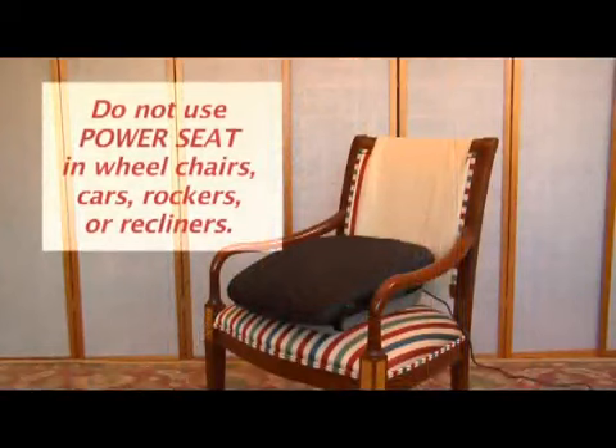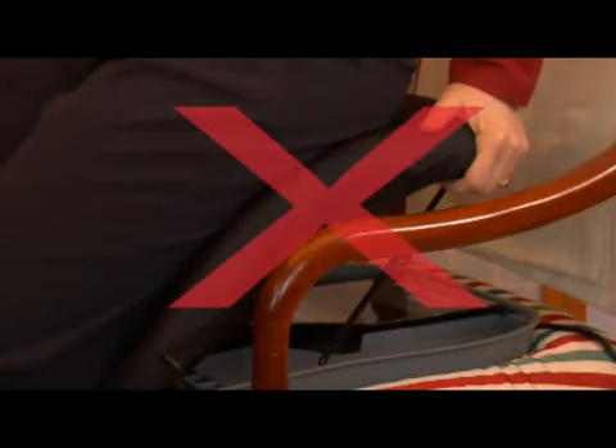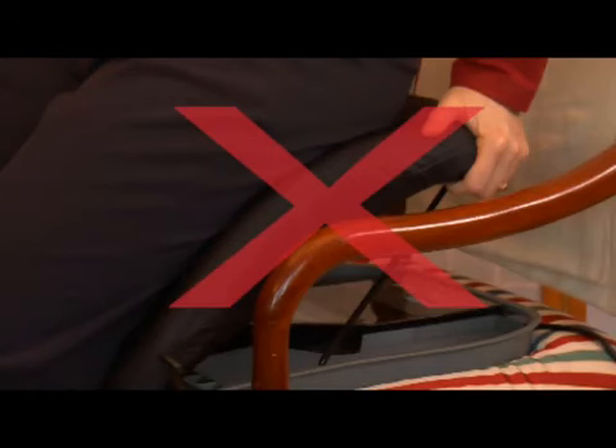This product is not designed for use in wheelchairs, cars, rocking chairs, or recliners. When using the PowerSeat, please be careful not to wrap your fingers around the sides of the cushion. Instead, always hold the armrests of your chair or sofa when sitting or rising.